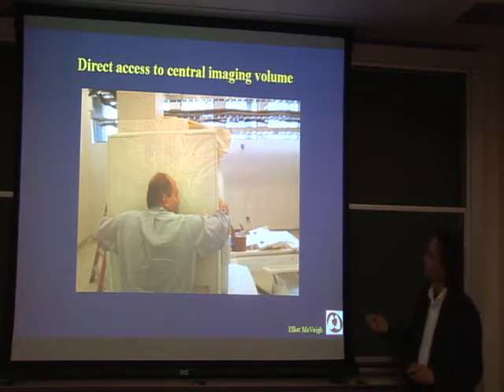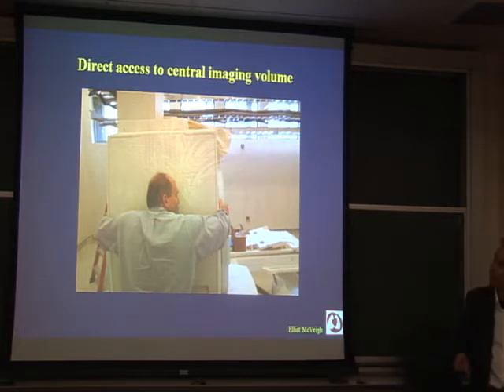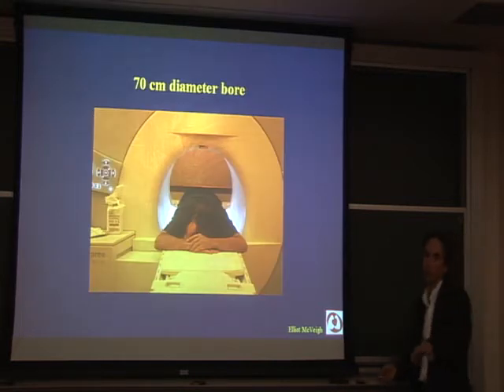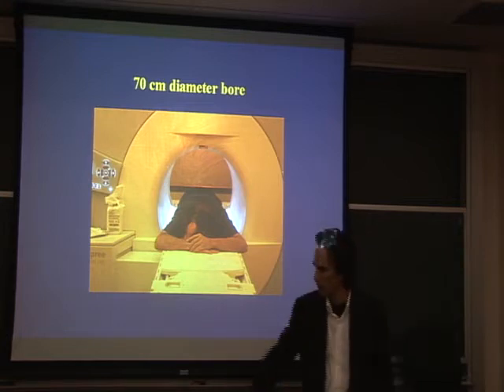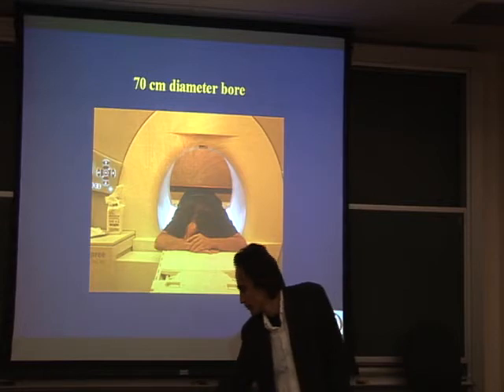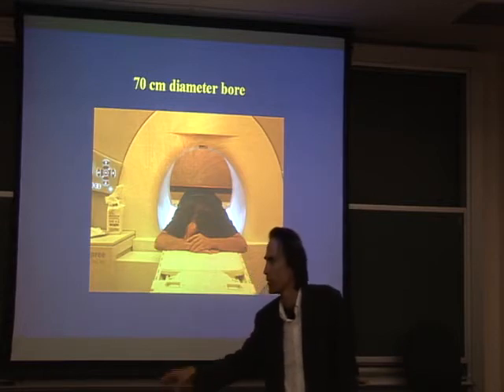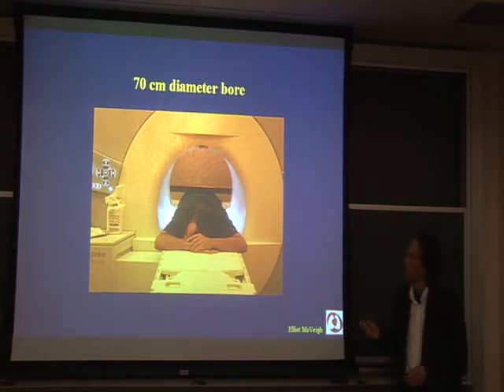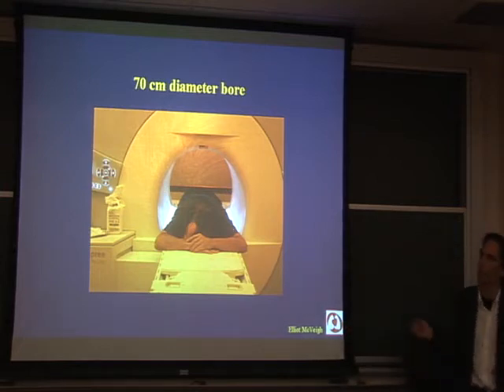Let's just buy one of these, and we did, and we embarked on trying to do interventions in this system, where you can directly manipulate the thing you're looking at on the scanner, because you can reach into isocenter and manipulate something while you're imaging. It's no longer than this, it's shorter than this table. And so isocenter is right here, right? So you can manipulate stuff. And it's scanning away, it has a cylindrical set of gradients, and so you lose about 25%.